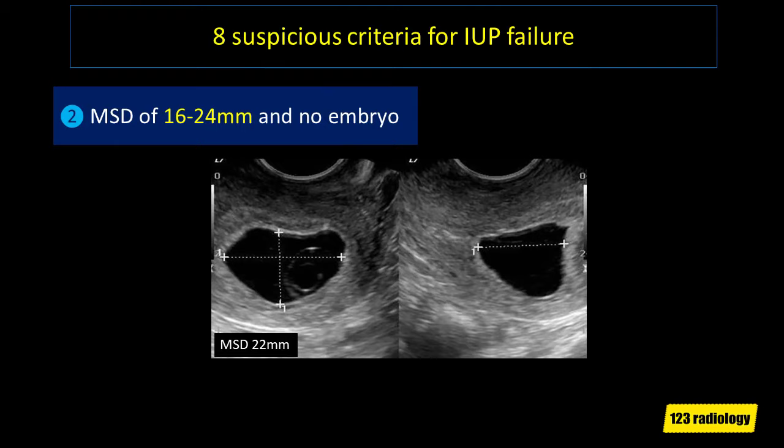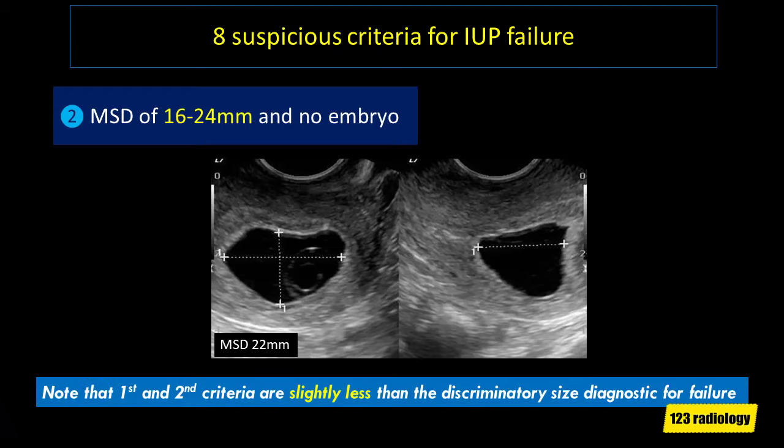The second suspicious criterion is a mean sac diameter of 16 to 24 mm with no visible embryo — slightly less than the 25 mm discriminatory size diagnostic for failure. As you can see on the image, the mean sac diameter is 22 mm with no visible embryo — this is suspicious for pregnancy failure and follow-up ultrasound study is highly recommended. Note that the first and second criteria are slightly less than the discriminatory size diagnostic for failure.